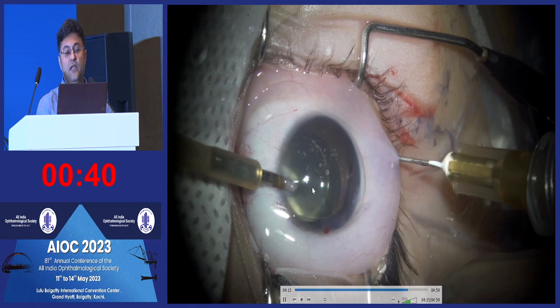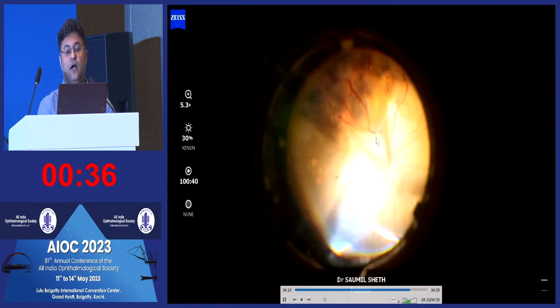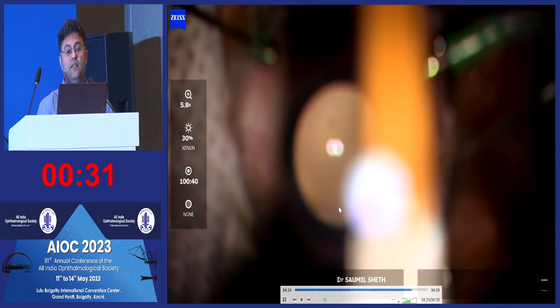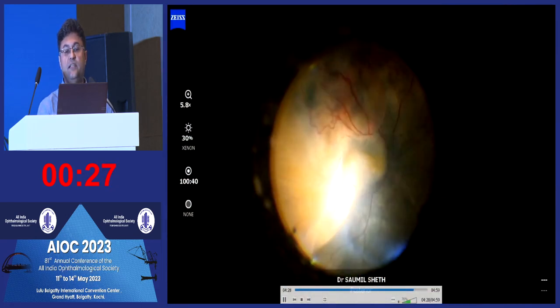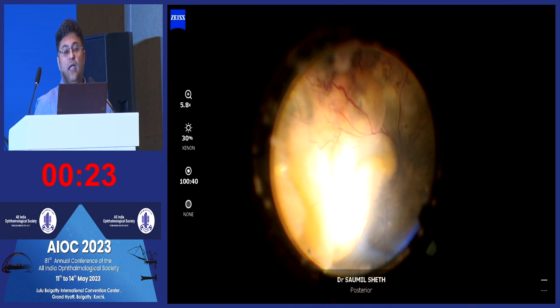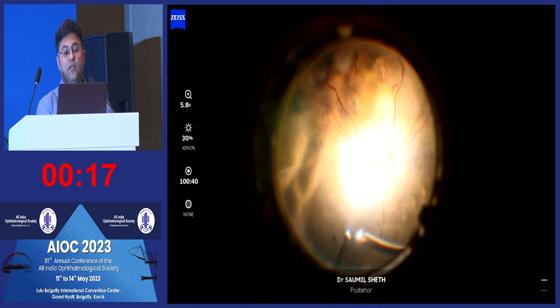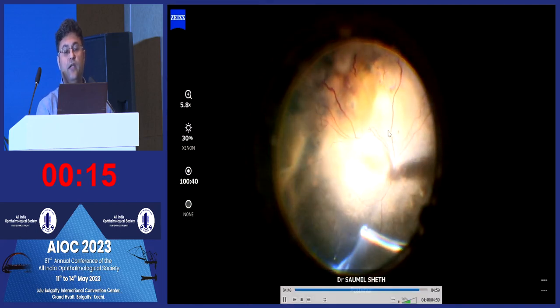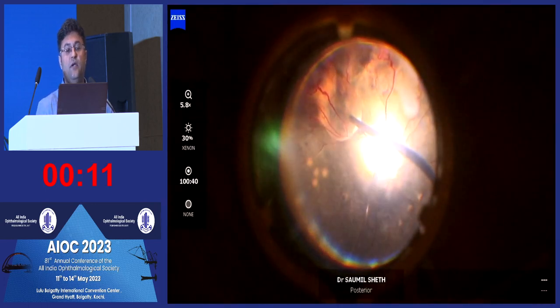We have a similar second case here where I'm going to be showing you an intraocular intervention. Again, a Coats disease where I'm doing a little bit of vitrectomy, but because there is no break in the retina, it is not going to settle. We need to do drainage. So we put this 26 gauge from here and you see the needle tip entering below the retina here, and the positive pressure of the infusion is actually pushing the subretinal fluid out through this needle. And after it cannot go beyond a certain point, we tend to release the vitreous so that the fluid gets more place to push the subretinal fluid out.